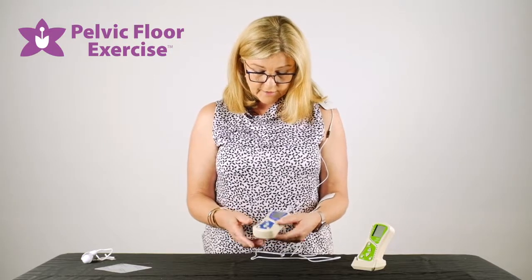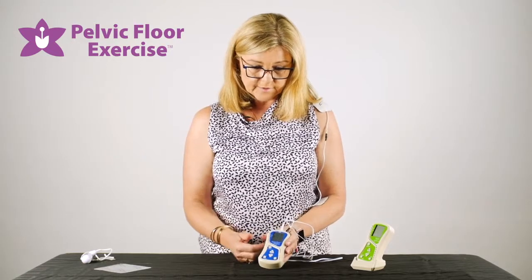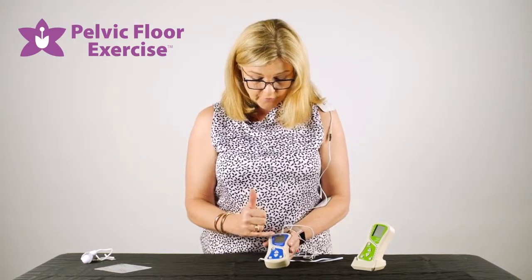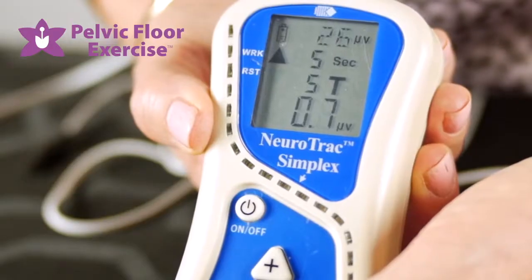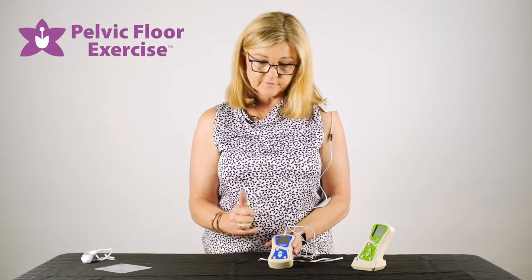You can change the threshold at any stage during the treatment and manually adjust it as well. On the screen you have the number of trials that you'll be doing, how long you're going to hold them, and the resting feature.